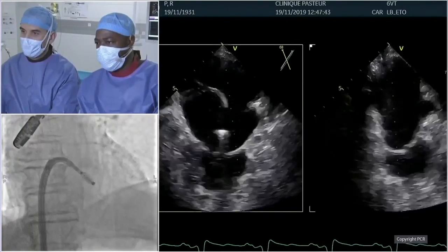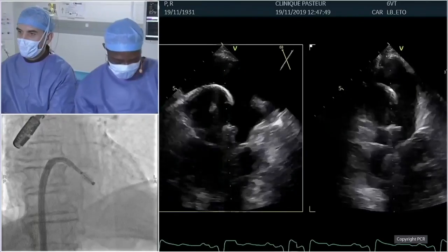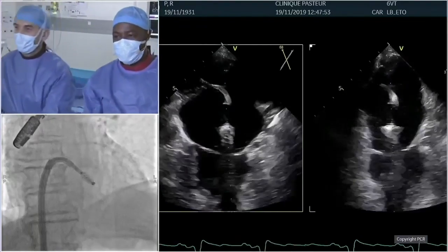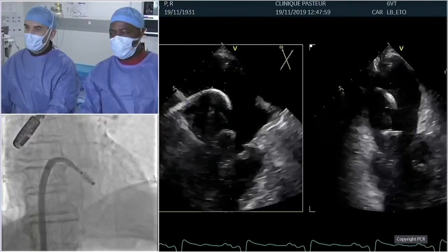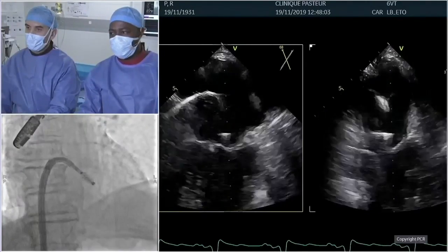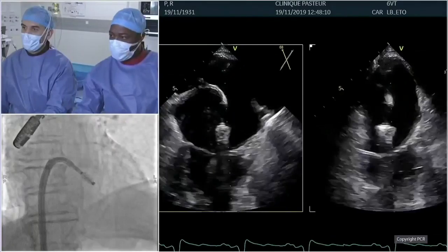My only concern is that the TEE probe is so perfectly positioned just behind the guide that one fear is that the acoustic shadowing from the guide itself is going to prevent you from seeing the arms. So sometimes we'll go a little bit deep and image it a little off axis and then just use a single plane in the grasping view. But we'll have to see once the clasps are open.